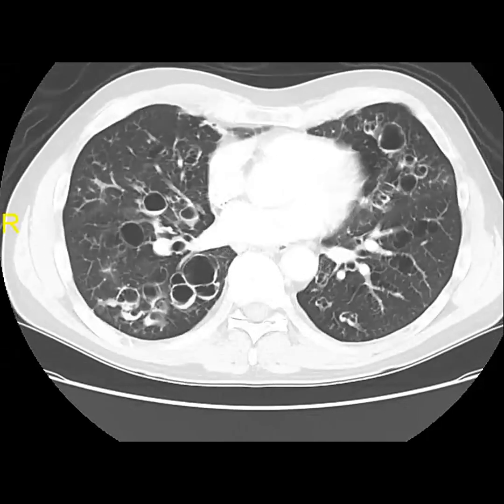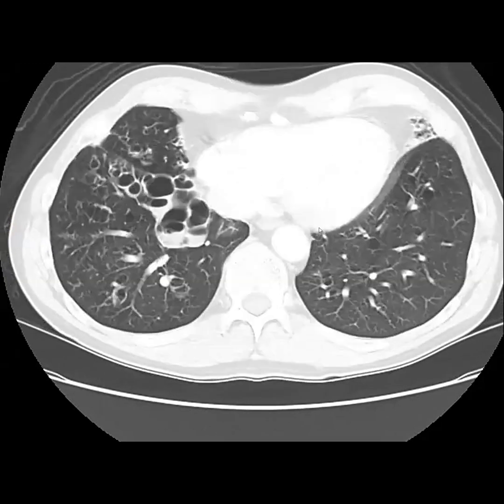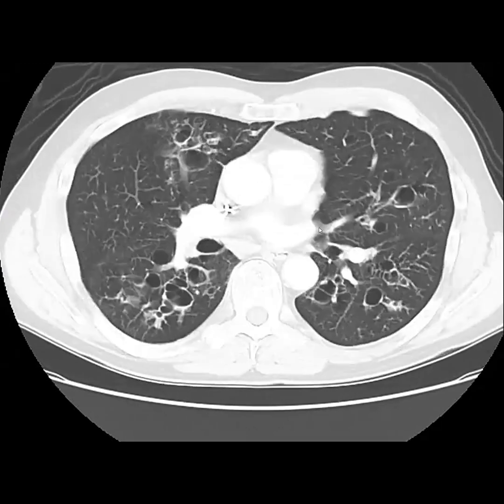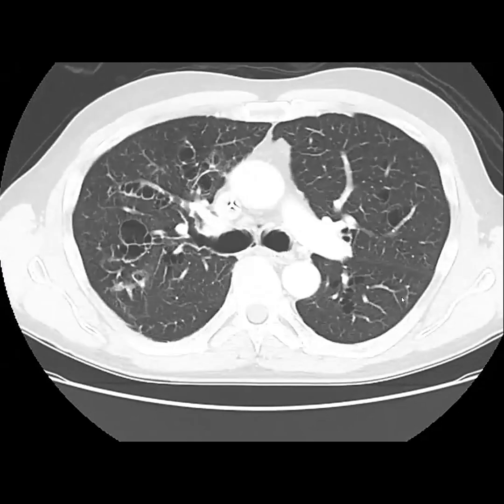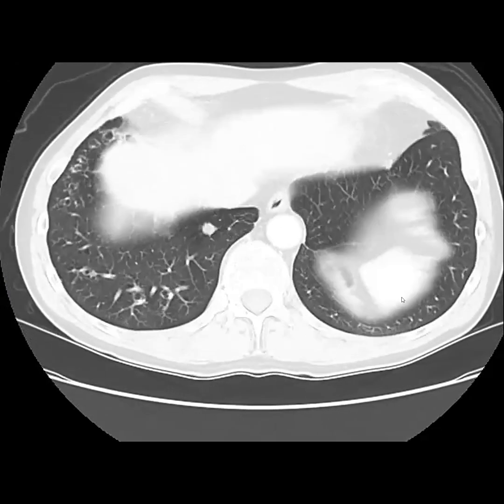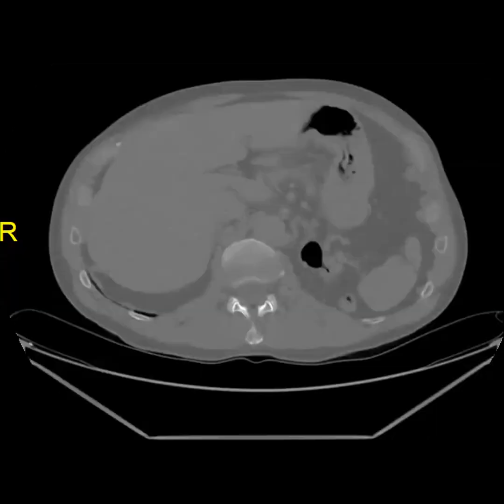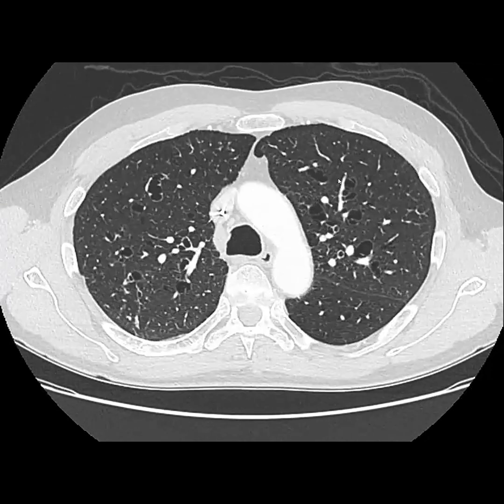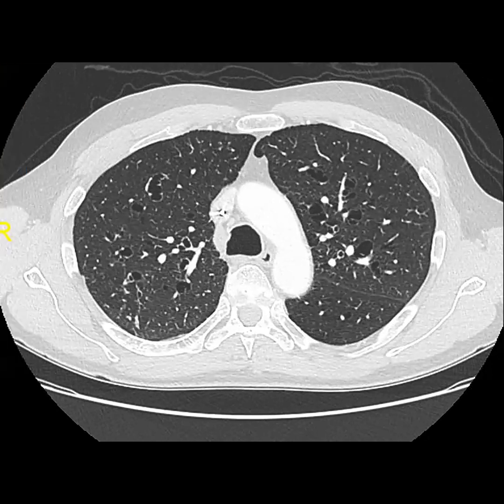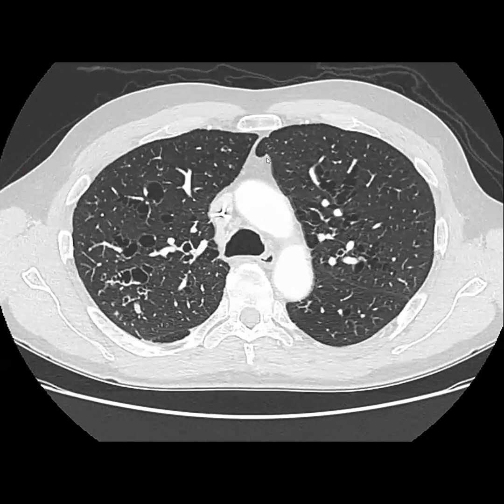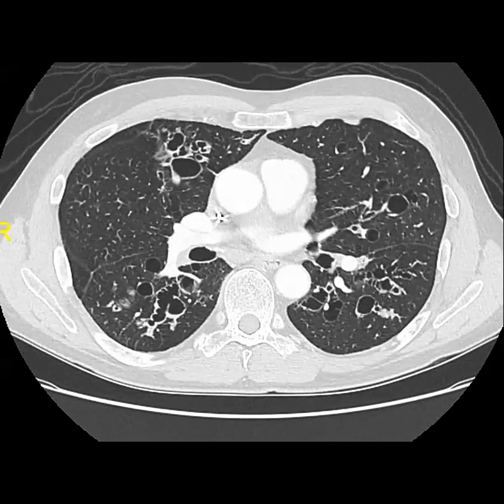Okay, this is a chest finding. There's bilateral varicoid bronchiectasis. My chest knowledge is a little remote, but I'm thinking histiocytosis — or the other thing is cystic fibrosis. This is a similar finding from a while ago that really hasn't changed. You're on the right track — it has a name. This is Mounier-Khün syndrome.